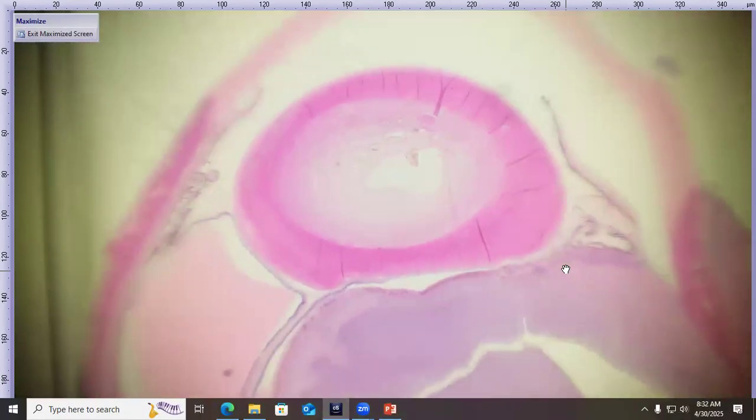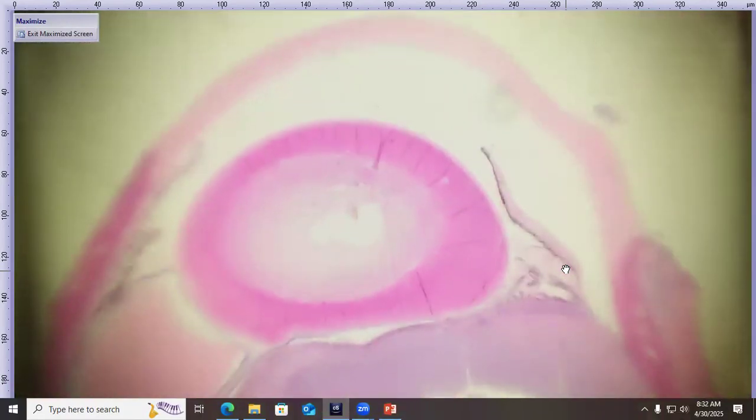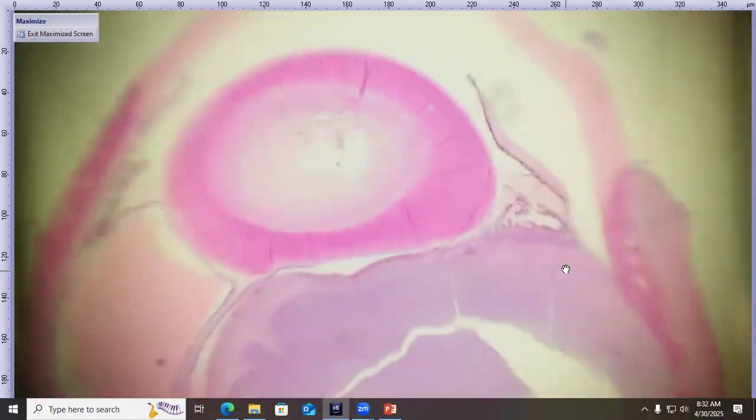There we go. It looks much the same as our gross. So we have a relatively quieter anterior segment. And then this large area that was tan on gross is, of course, very, very purple on histologic exam, supporting that this is a really cell-rich population at the site.